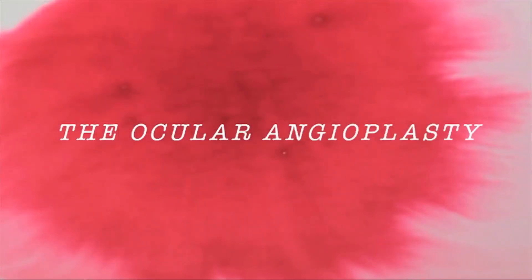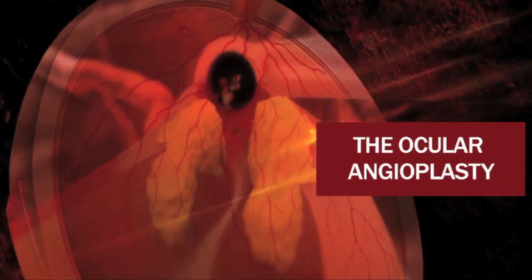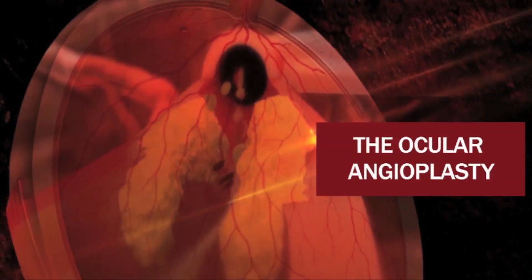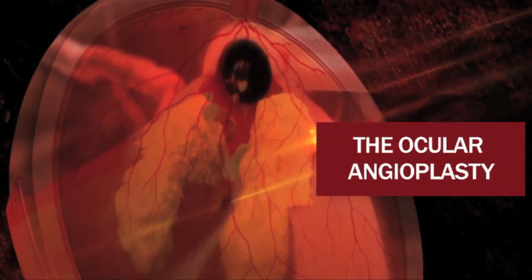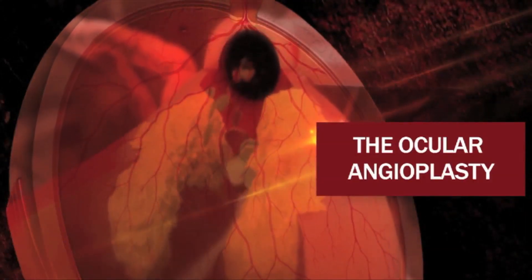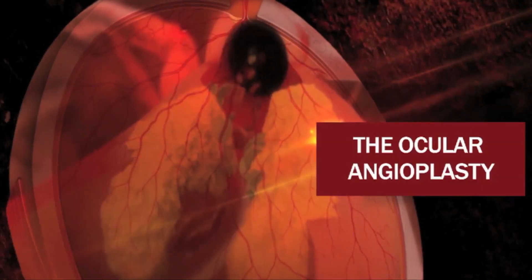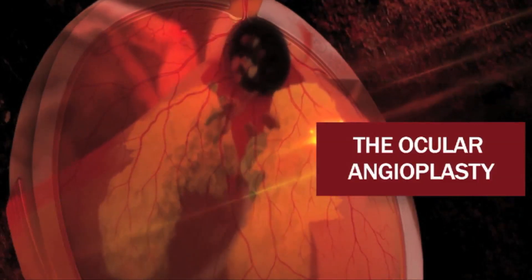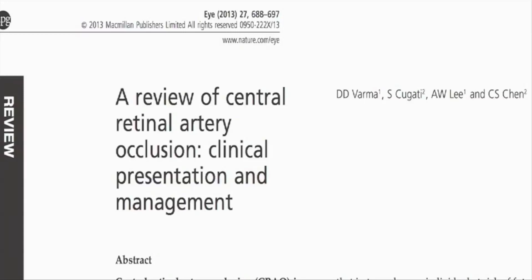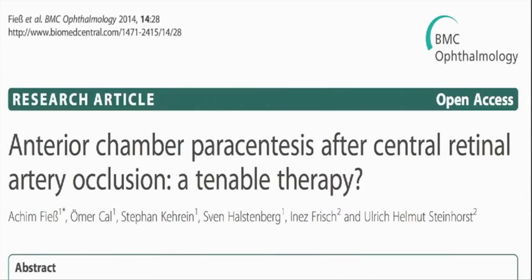Central retinal artery occlusion is an ocular emergency resulting in profound monocular vision loss and is the ocular analogue of a cerebral stroke. It is usually caused by an embolus leading to significant reduction in retinal perfusion. Lack of evidence-based practice guidelines has resulted in several treatment options, both medical and surgical.